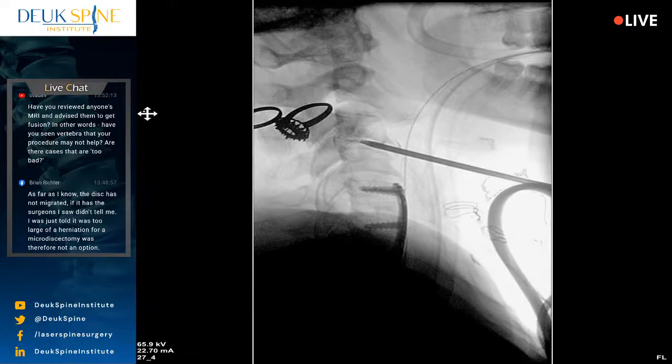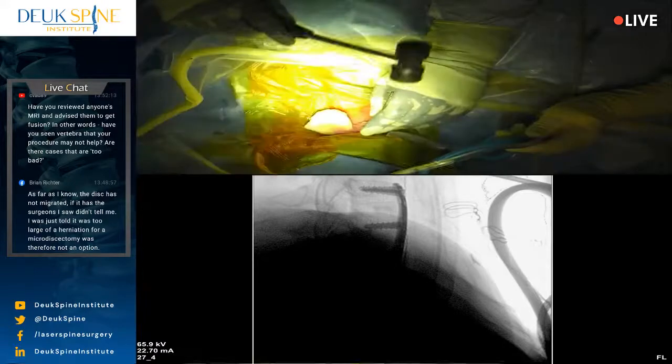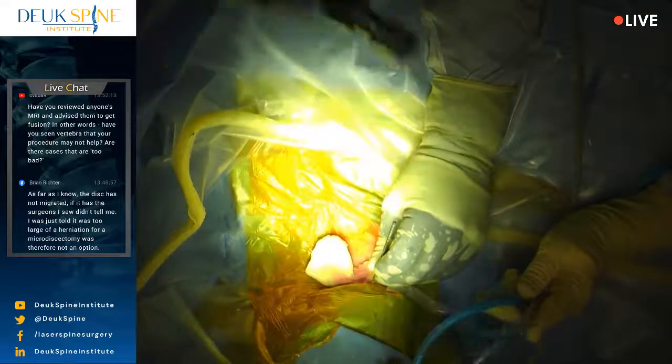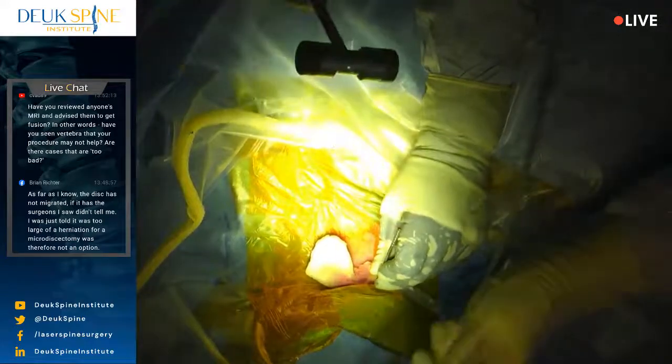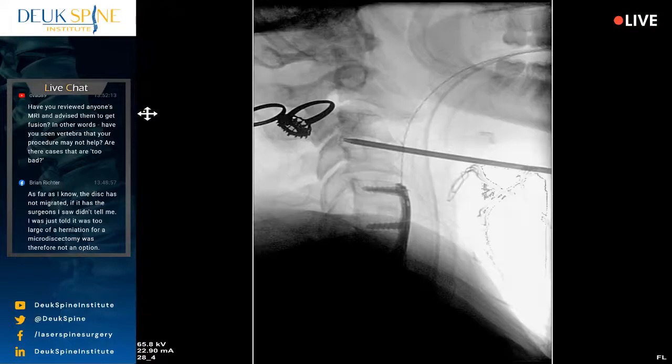All right, we've lost, what, 5 drops of blood. So we're at 1/4 of a milliliter. Mallet. Can you imagine doing cervical spine surgery with 1/4 of a milliliter of blood loss? I don't have to imagine it. We're just about there at the back of the disc, and it's beautiful. Absolutely beautiful.